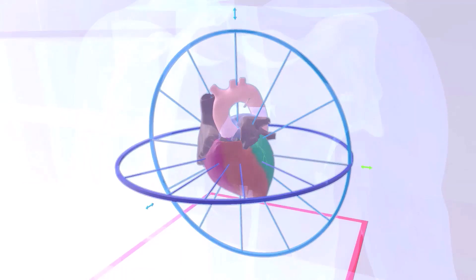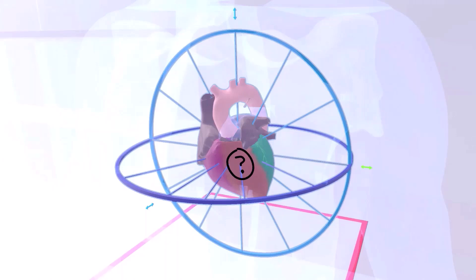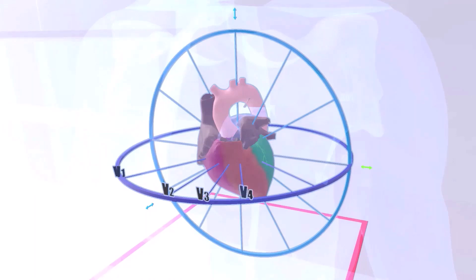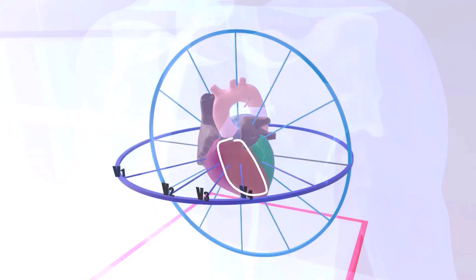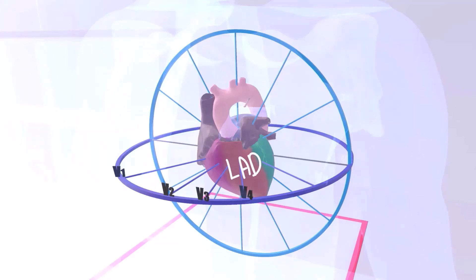In the case of an infarction which affects the anterior part of the myocardium, the leads facing the anterior part of the heart are V1, V2, V3, and V4. So in an infarction affecting the anterior myocardium — generally associated with a left anterior descending artery infarction — we would see changes at V1, V2, V3, and V4.